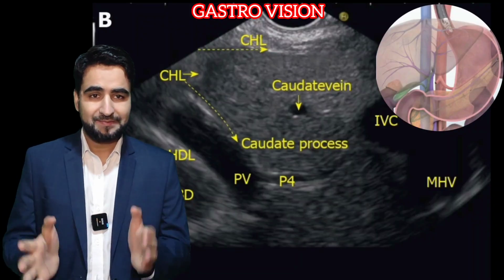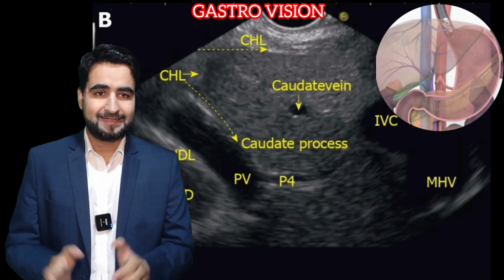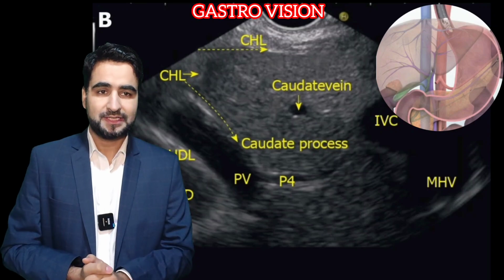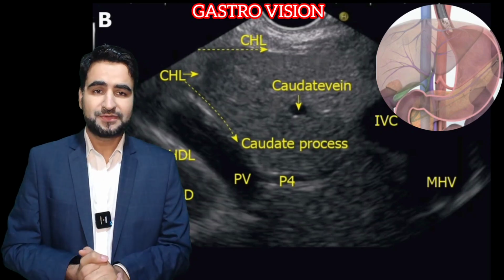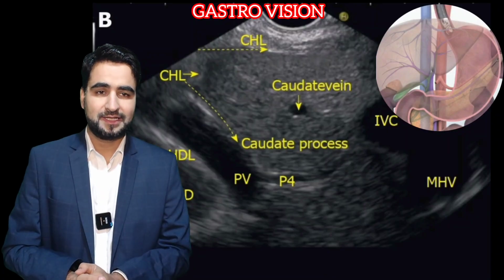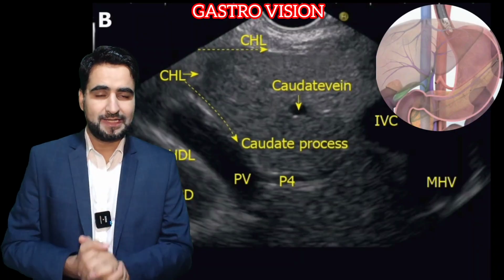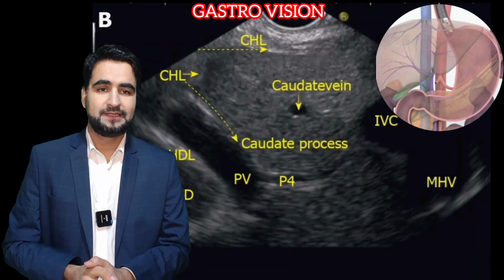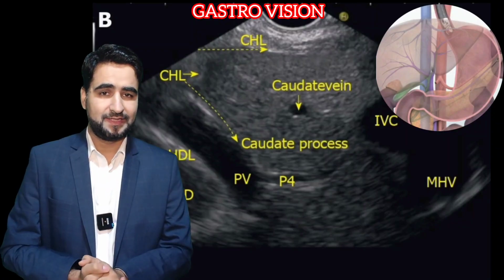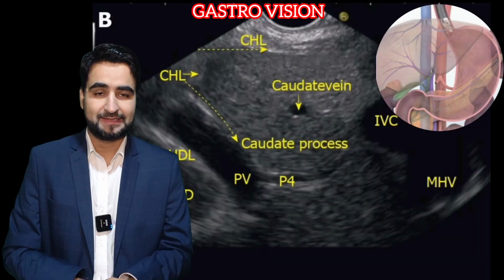During rotation, the hyperechoic gastrohepatic ligament between the esophagus and liver and the hepatoduodenal ligament near the liver hilum can create acoustic interference. This may obscure the right and left hepatic ducts near the confluence, causing partial acoustic shadowing or dropout. On the right side of the image, note the large anechoic tubular structure. This is the inferior vena cava. You can also see the middle hepatic vein joining it, which is an important venous landmark when orienting the hepatic hilum during endoscopic ultrasound.